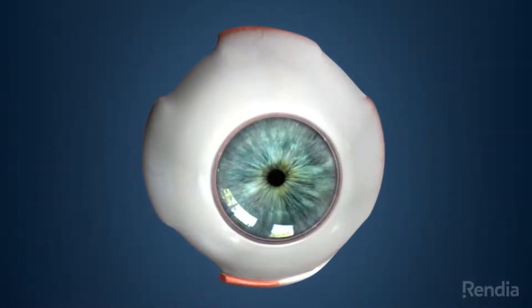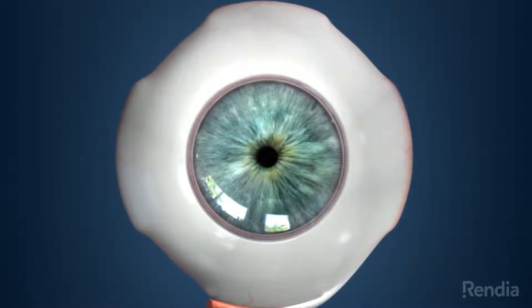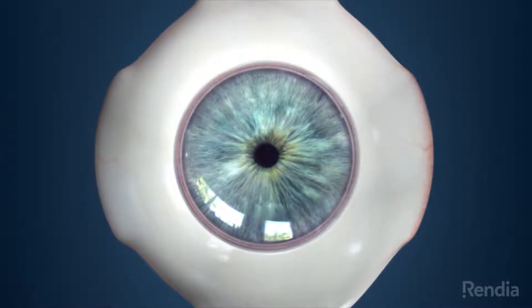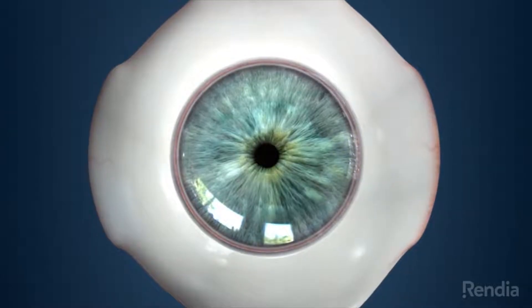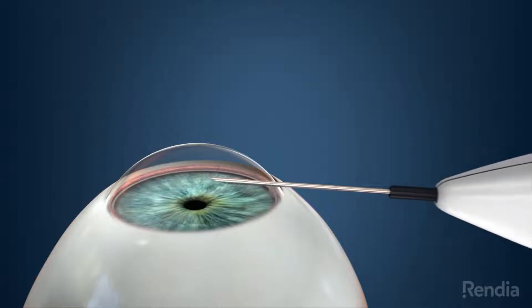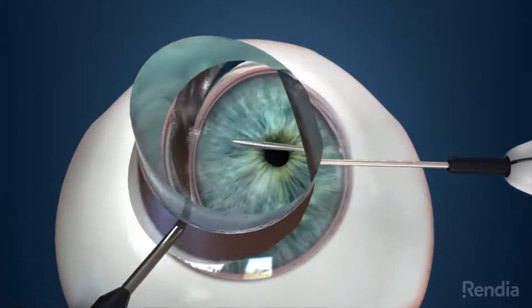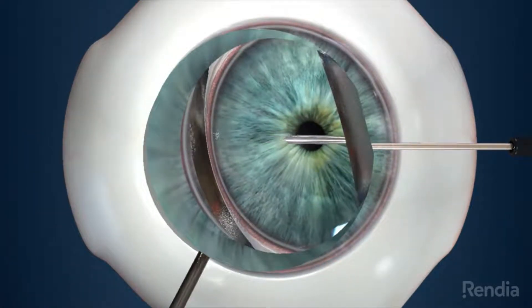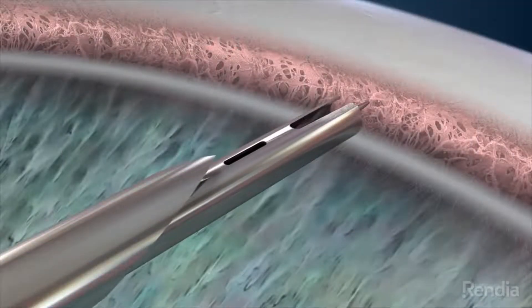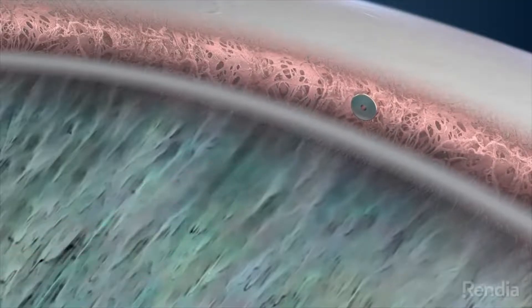The Eye Stent Infinite implantation procedure is straightforward and performed with a minimally invasive procedure. First, a topical anesthetic drop is used on the top of your eye and a small opening is made to access the front part of your eye. Next, the Eye Stent Infinite inserter is moved through the opening to the tissues where fluid normally flows out of your eye, and the first stent is implanted, creating a tiny channel to restore fluid drainage from your eye.